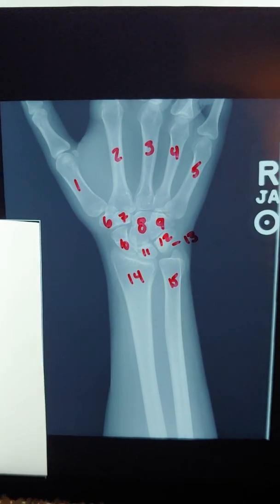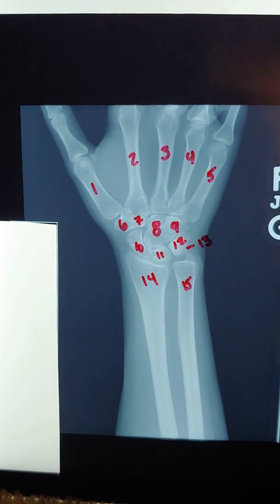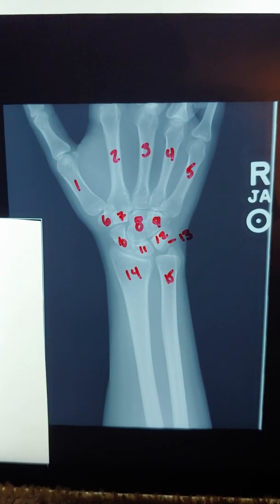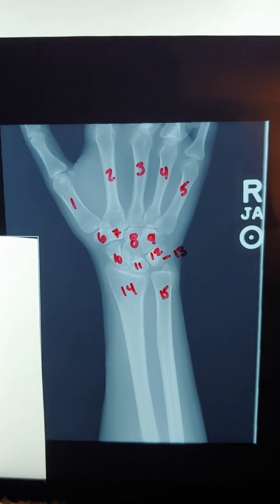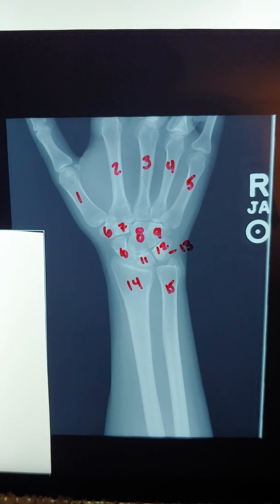My EI number was 2016. For Carestream, all exams should be within 1500 to 1800 and extremities should fall at about 2000. So it was in range for proper diagnostic.